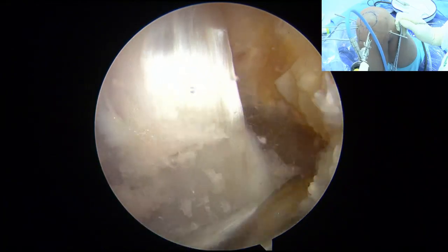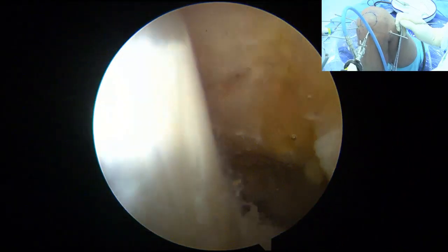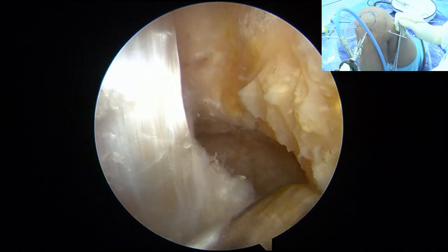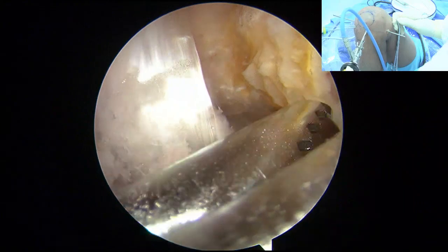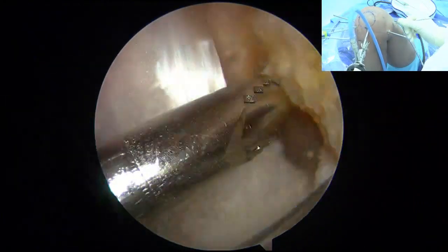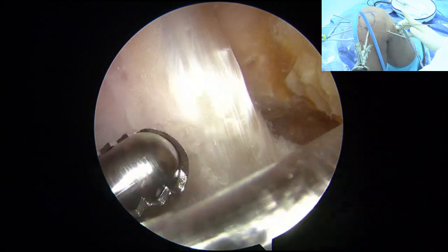好，每隔2毫米是1号转，现在是8号。Okay, here you can see that the posterior cortex is still intact. See that the posterior cortex is not blown out. 每转一步呢，都检查一下后方皮质，都确保它是完整的，没有转穿。Okay, good. And we are still in the tunnel, in the middle of the footprint.